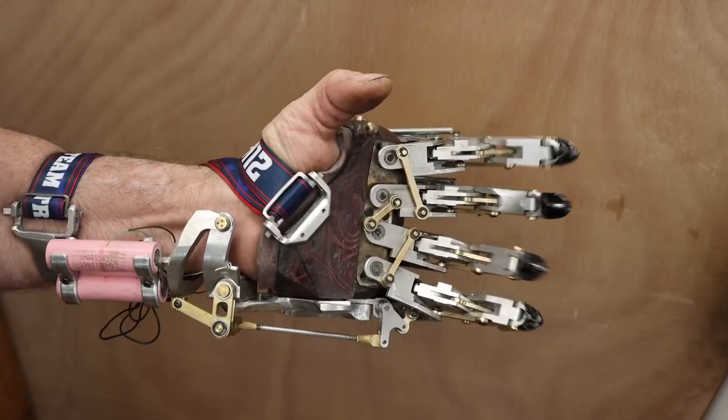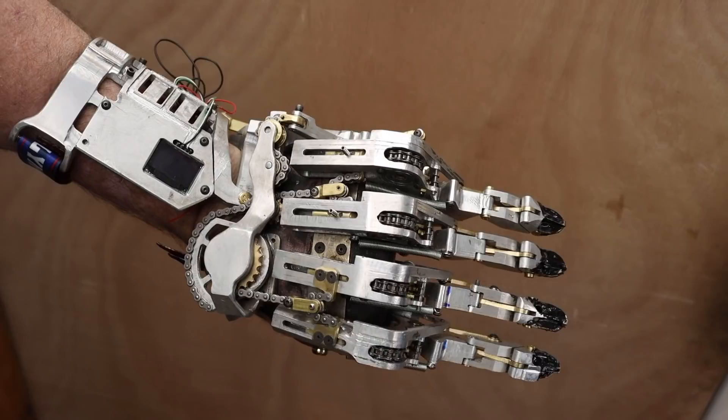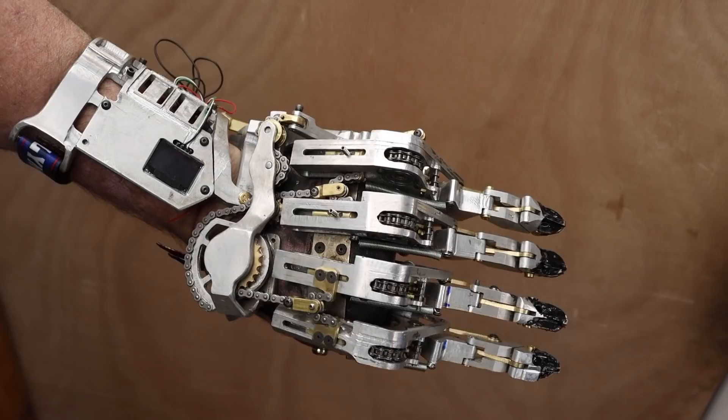As you can see, the fingers articulate with the lateral motion of my residual limb, just like with my current hand. Although with this version, the splay is much more positive. It still needs a bit of refinement before I'd consider it a finalized design, but I thought you'd like to see what I've come up with.